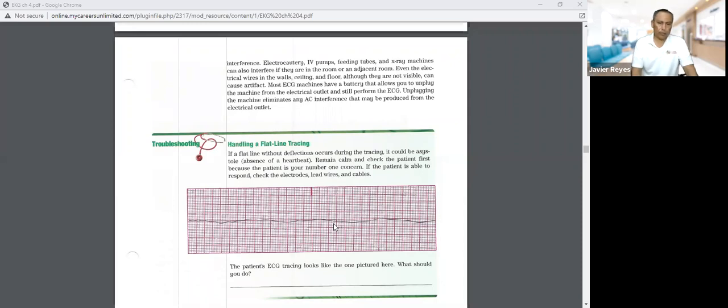That's why sometimes in pediatric places you see the staff wearing uniforms with stickies and cartoons and all these things to make the children a little bit more at ease, so they don't get all nervous. Of course, you have to get consent from the parents, and instruct the child, in their own level of understanding. We're going to put some stickers on you, so that they can feel a little bit more at ease and understand what's about to go on.